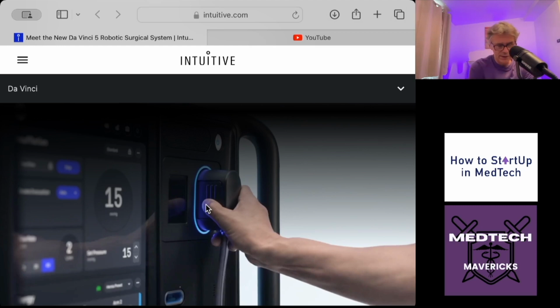And just as a note on the electrosurgery, in the past, Intuitive used to have weird settings like 1 to 5 that people didn't understand. So they've gone back now to what people understand, which is the wattage settings. So, how many watts of power you're putting through there, because people just understand that better. So that's just another good example of Intuitive listening to the customers and giving the customers what they really need, rather than just being blockheaded about the fact of we'll have it our way. So I think that's really, really good.